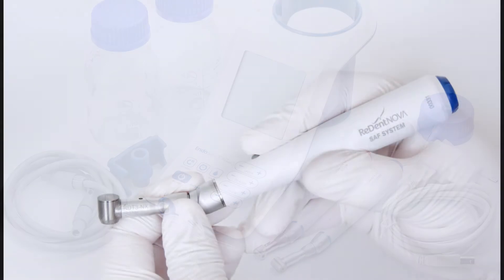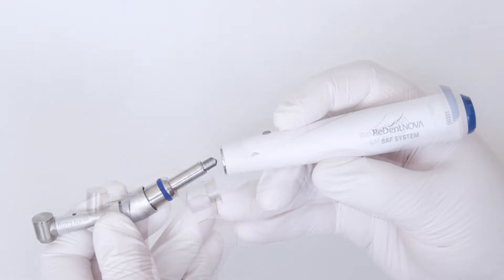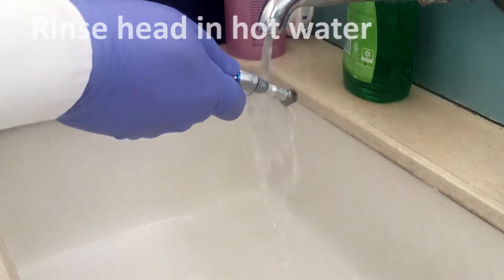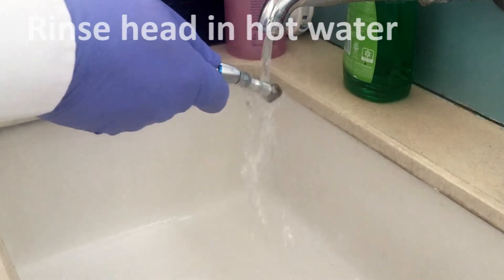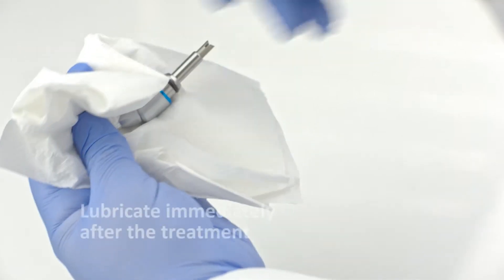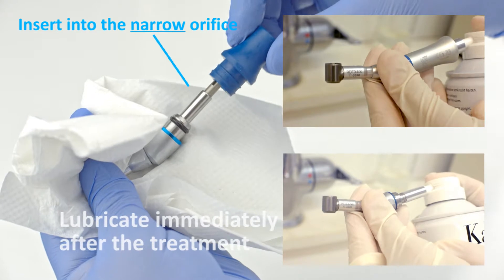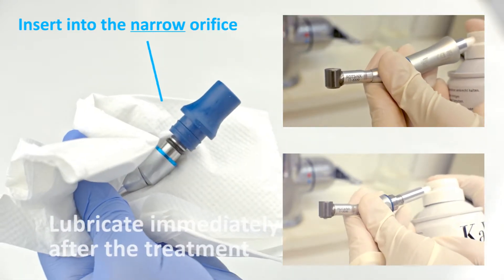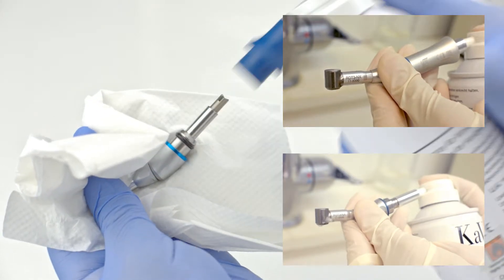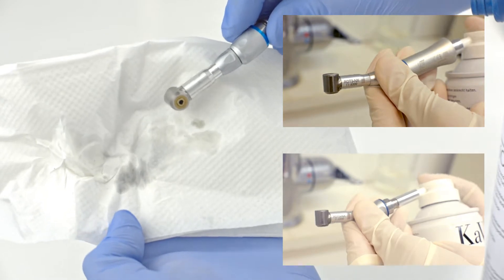As sodium hypochlorite is a potent corrosive, two steps are required to prevent cumulative corrosion damage. The first step, to be carried out after each use, is to lightly rinse the RDT3 head and adapter under hot water, wipe and lubricate them. Lubricate the RDT3 head immediately after the treatment while it is still connected to its adapter. Fit the oil spray nozzle to the adapter, ensure connection in the correct direction as shown in this video, and spray shortly until clear oil comes out of the aperture of the handpiece head.